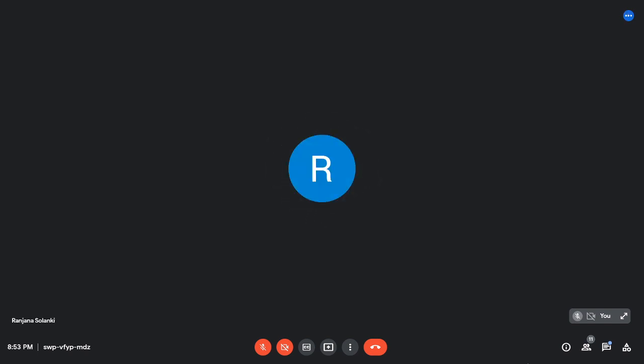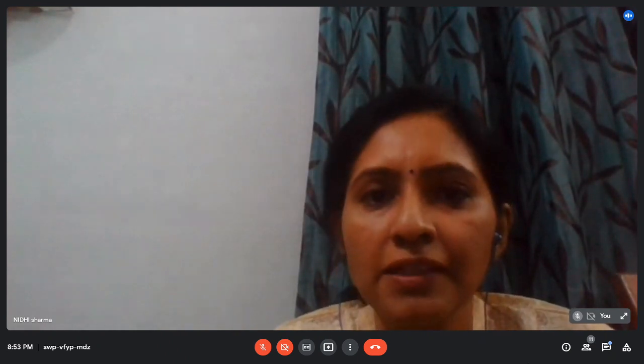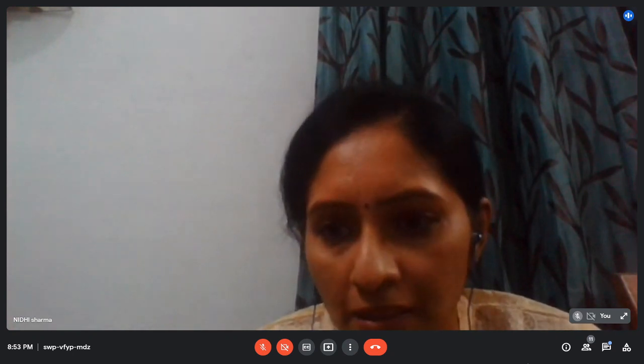There is another question from Dr. Nabanita Das. She says, in an ET case, is it necessary to try hard to give an accurate platelet count? Like 8 lakhs versus 10 lakhs has a difference of 2 lakhs, but machine or manual values may not be accurate. So, I don't think a difference of 8 to 10 lakh is going to change anything in the management. You see, ultimately you would try to make efforts in an area where it would make a difference in the management.